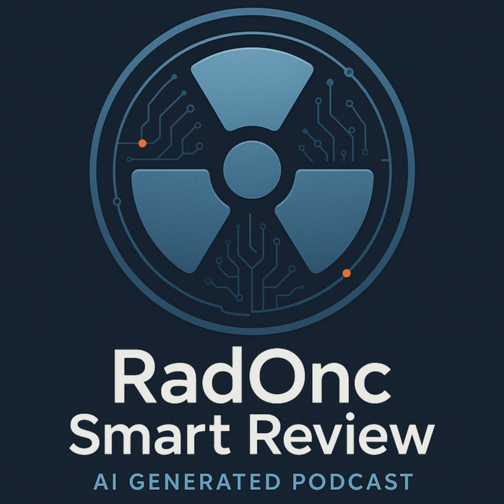Okay, let's get started then. To really appreciate the LINAC, we should probably look back first. The radionuclide machines, the Cobalt 60 era. Yeah, before LINACs became ubiquitous, Cobalt 60 was really the standard for external beam. The source itself, Cobalt 60, is radioactive. It's made by taking stable cobalt-59 and hitting it with neutrons in a reactor.